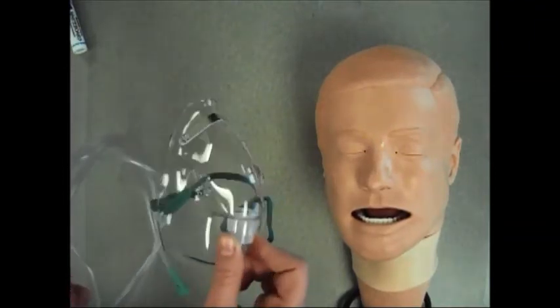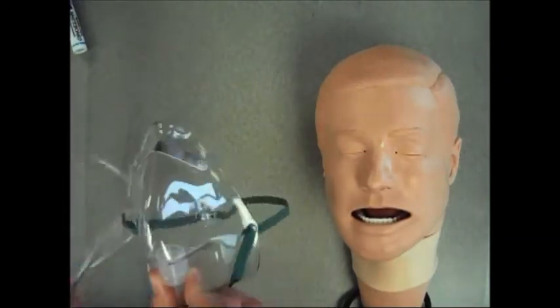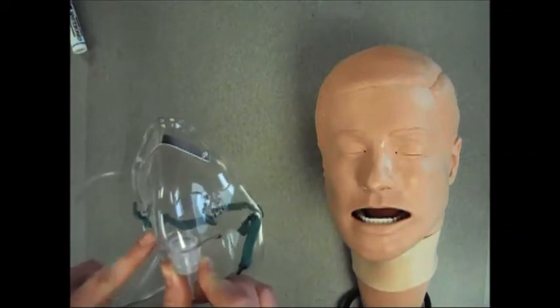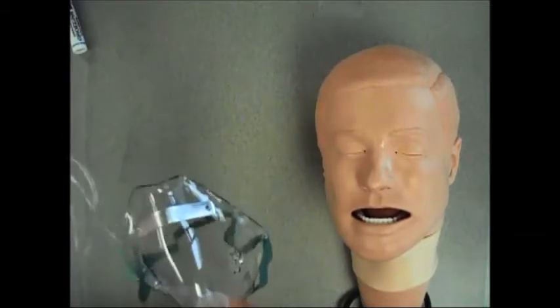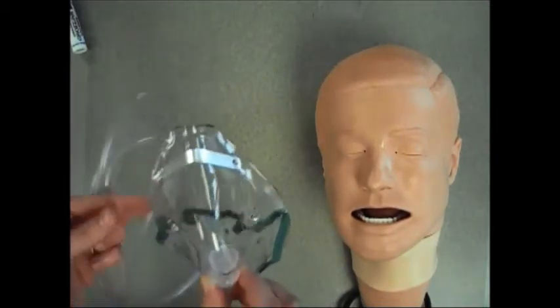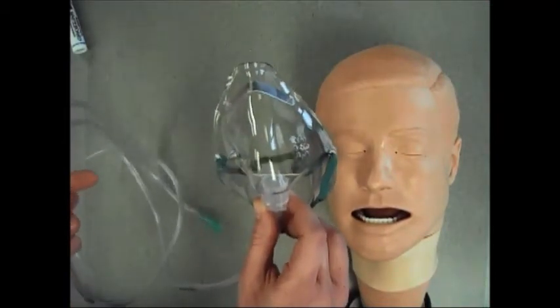The simple face mask fits over the nose and mouth, and I will show you that in just a second. The metal piece at the top of the mask is placed at the bridge of the nose and it allows the face mask to be a little bit more secure to the patient.